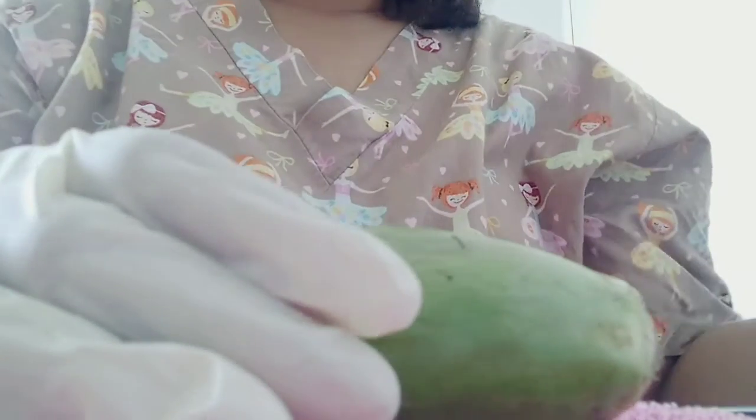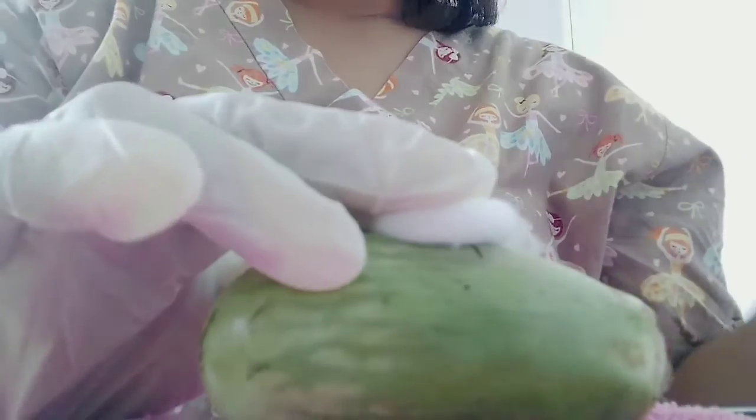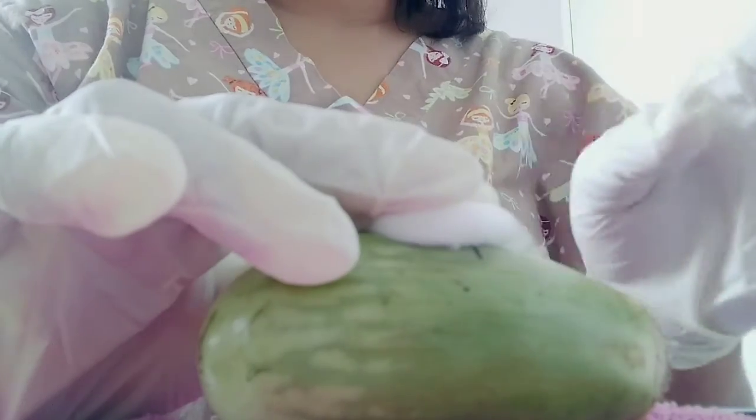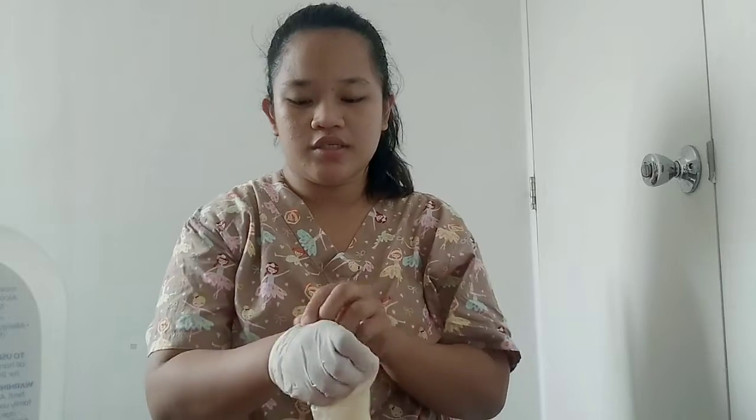Then we are going to release the skin and place a gauze or a swab. Apply gentle pressure on it, but do not massage the area. Then place the patient in a comfortable position. Then document the procedure that you have done and remove our gloves. Then perform hand hygiene.